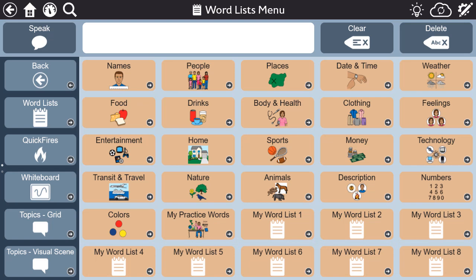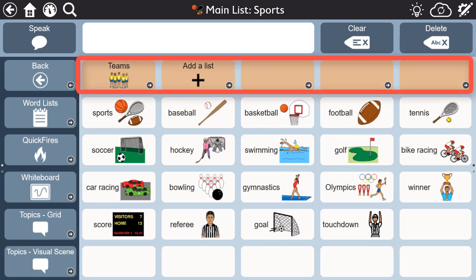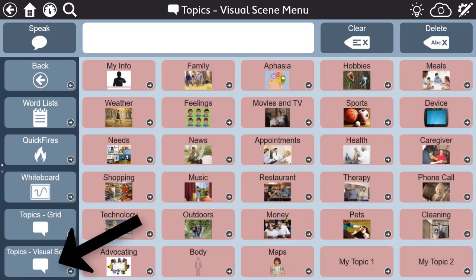Third, many people with aphasia have trouble attending to the right side of their visual field. Therefore, we avoided putting frequently used content on the right side of each page, as seen here in word lists, and here in visual scenes.